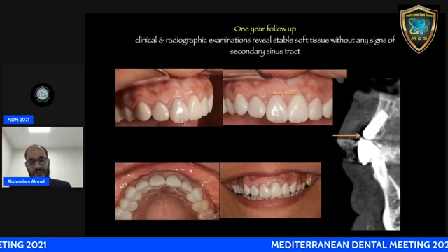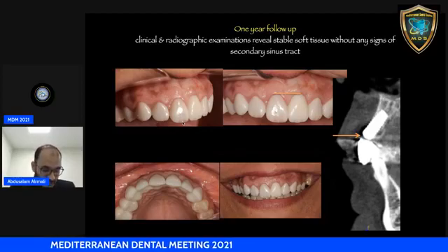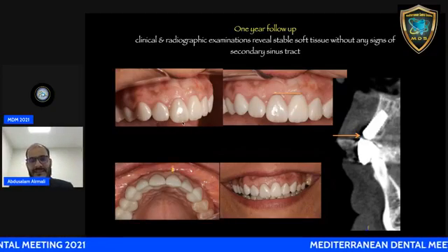And this is the patient smile. This is a critical case because the patient has a high smile line. We try to optimize the final aesthetic.